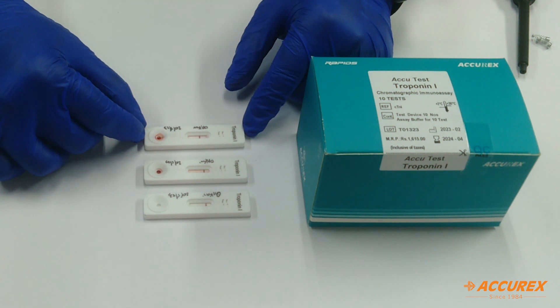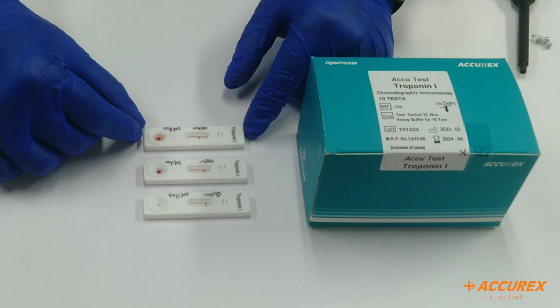In this way you can give the patient result in 10 minutes. One more thing: do not take the results after 20 minutes, as it may show false negative or positive results. In this way you can give the results to the customer within 10 minutes. Thank you.